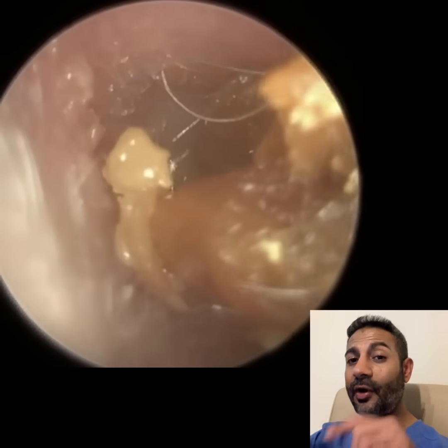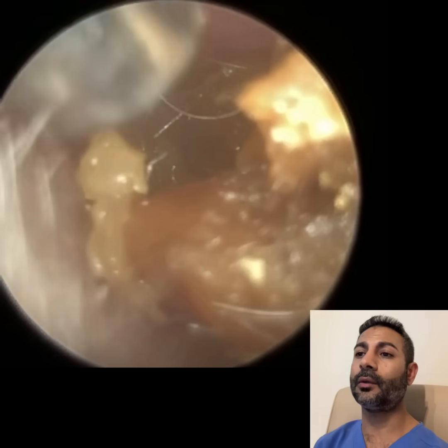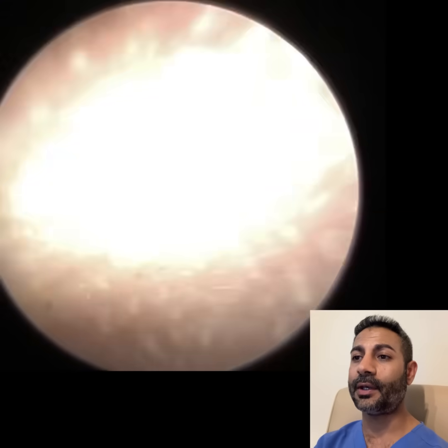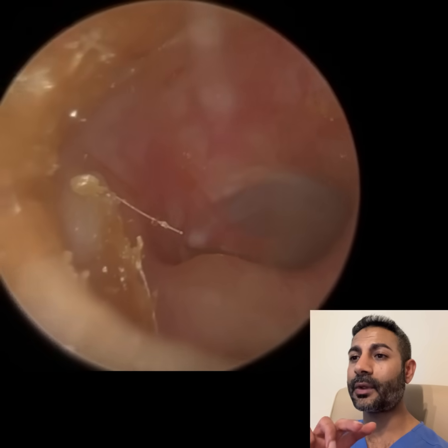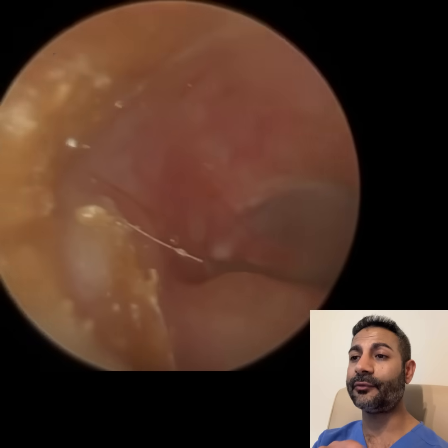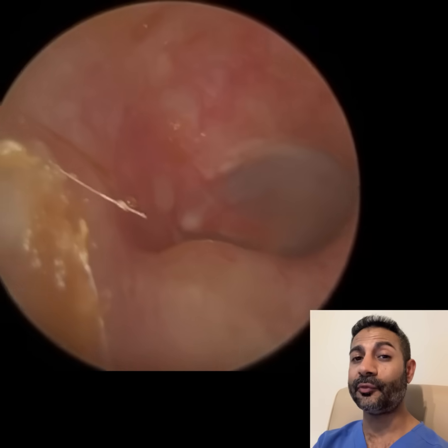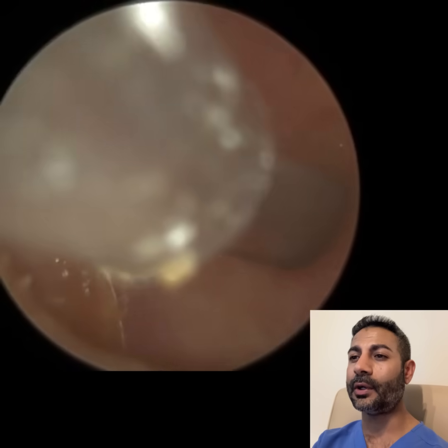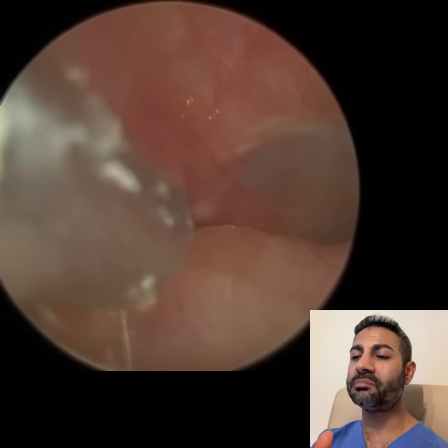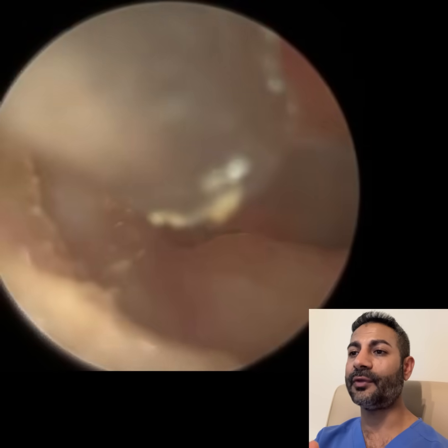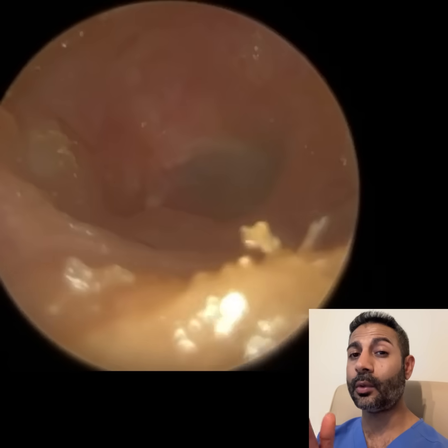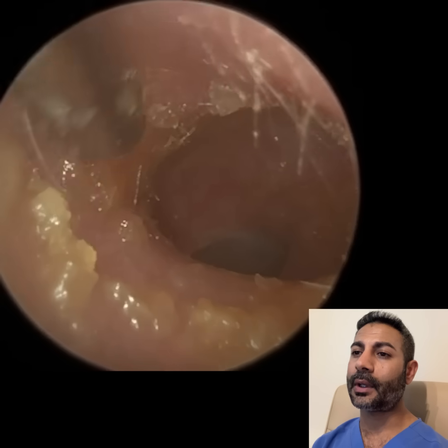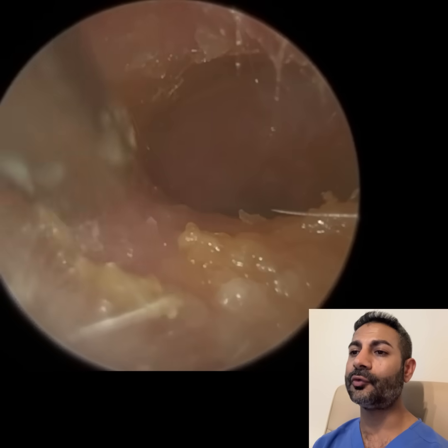Those regions — that triangle where these bony spurs normally appear — the reason why they appear there is because the skin is slightly thinner in that region, so the periosteum is a bit more exposed. Now in this ear, this patient's got a solitary one, more at about seven or eight o'clock. You can see it on the anterior canal wall, the left-hand side. The right side has an additional two — three in total.